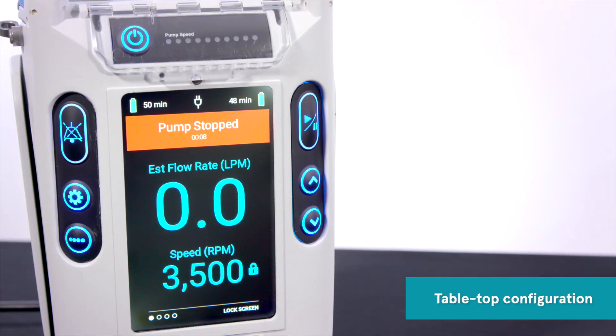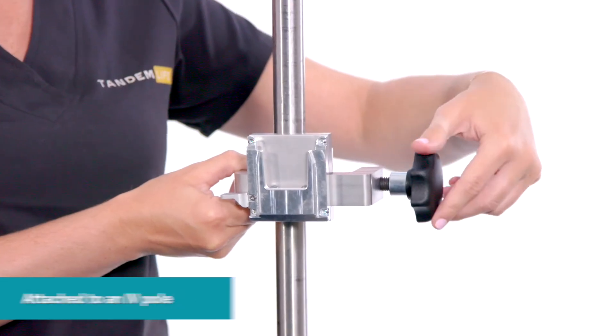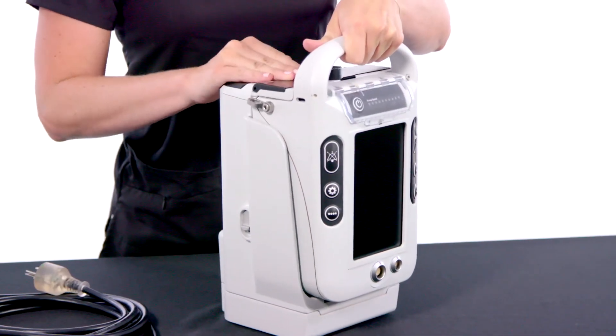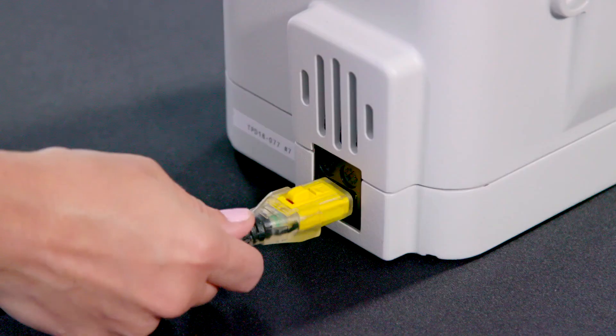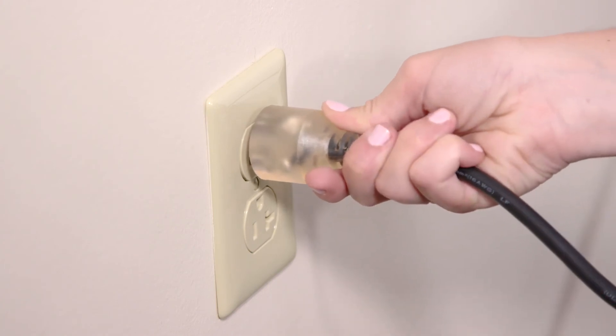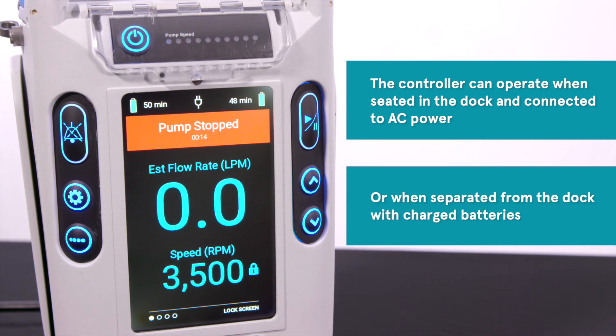The controller and dock can be used in tabletop configuration or attached to an IV pole utilizing the IV pole clamp provided with the system. First, verify that the controller is fully seated into the dock and connect the power cord to the rear of the dock. Plug in the AC power cord to an AC outlet. The controller can operate when seated in the dock and connected to AC power, or when separated from the dock with charged batteries.